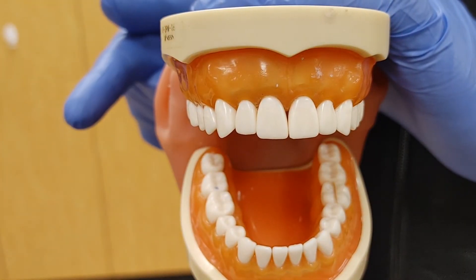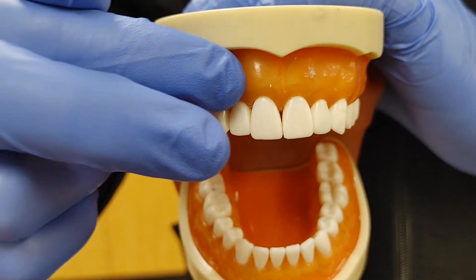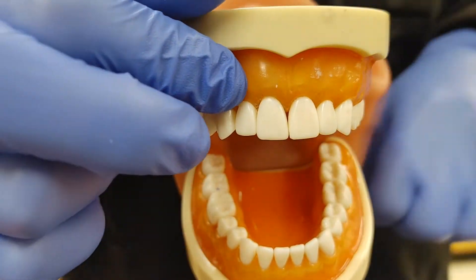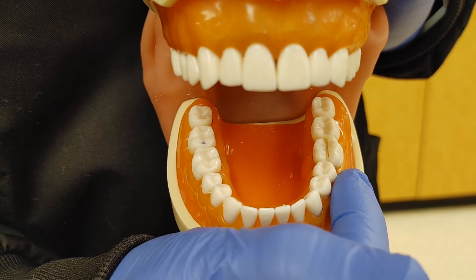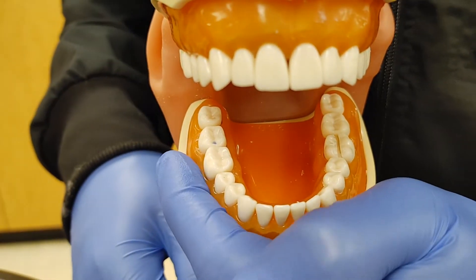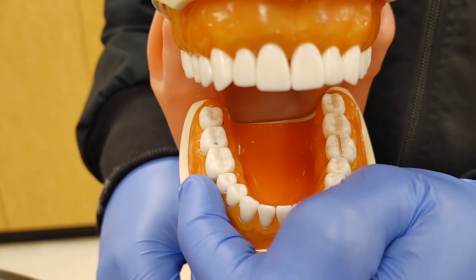With our palpation test, we're going to be using one to two fingers right along the gum line and putting consistent pressure so that we can activate any abnormal areas or abscesses that may be festering below. Be sure to check around the neighboring teeth and the opposite side to get a baseline normal reading. Inform your patient to raise their hand if any type of sensitivity or zing starts happening.